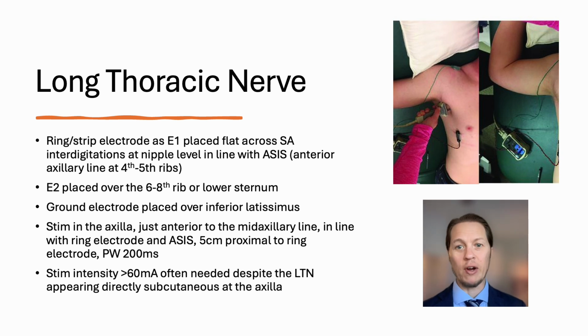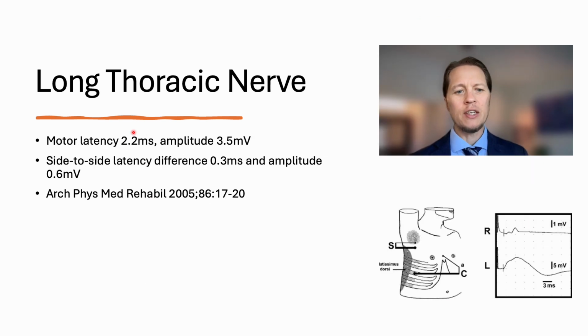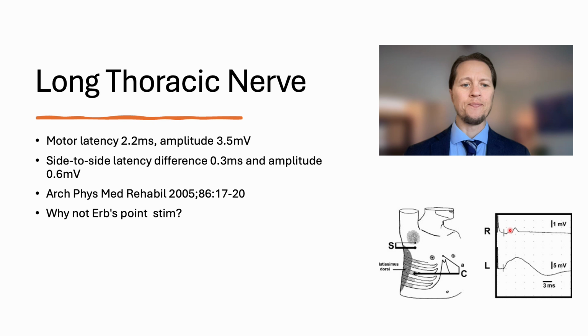You got to crank it up. These are some reference values that are out there if you are not comfortable doing it or you don't happen to do the other side for comparison, although you usually like to. This is kind of the waveform that you get on the affected side, and the other side should be a nice, clear difference. We got a really bad waveform there in our case.